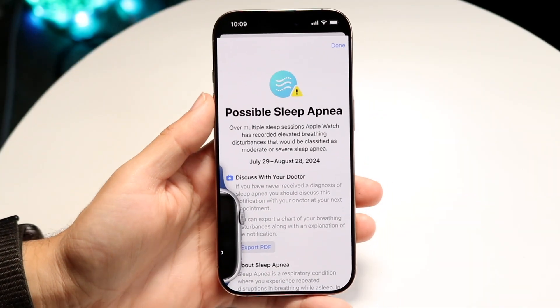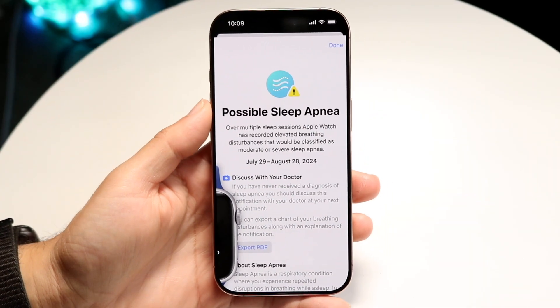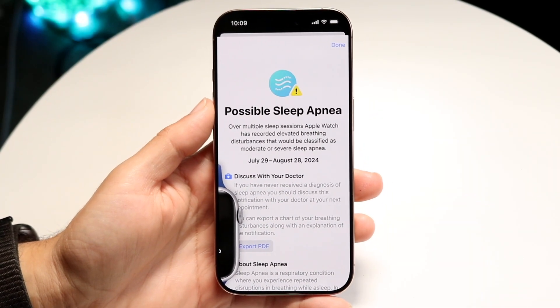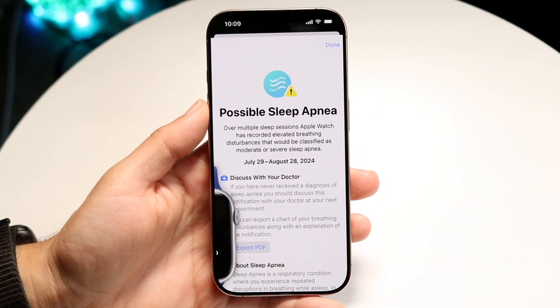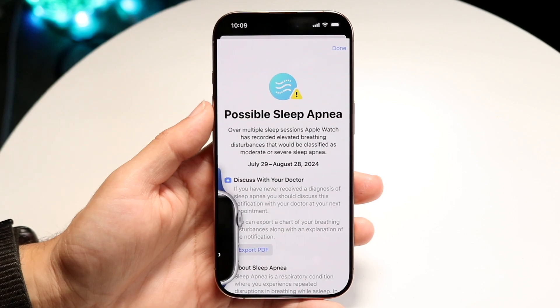You might be trying to figure out how to enable the sleep apnea notifications on your iPhone and Apple Watch.